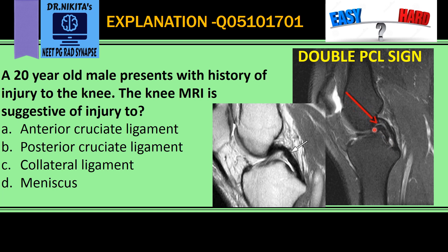This second PCL-like structure is actually the flipped fragment of the medial meniscus, which comes and sits here after there is a bucket handle tear of the meniscus. This torn fragment of the meniscus comes and sits anteriorly to the actual PCL, giving the double PCL sign of bucket handle tear of the meniscus.